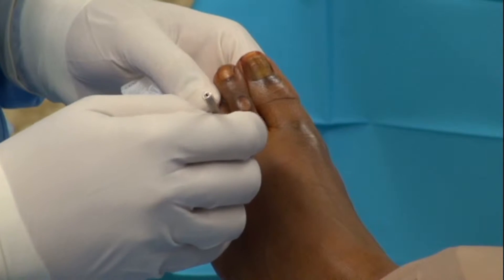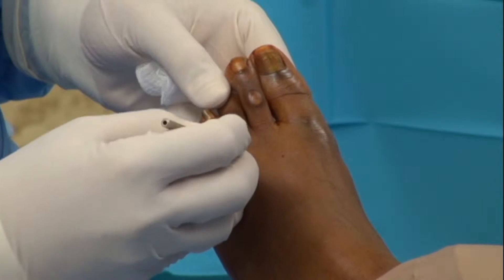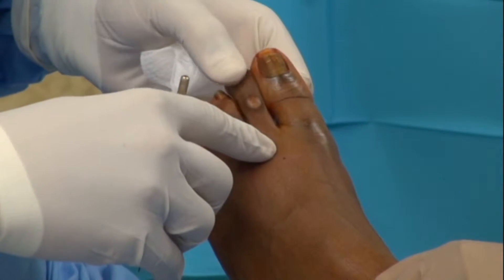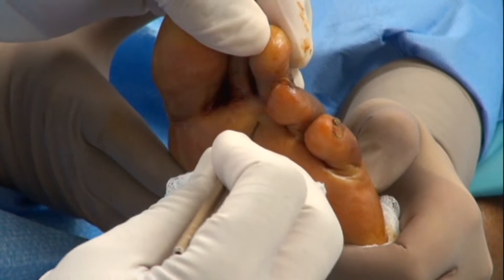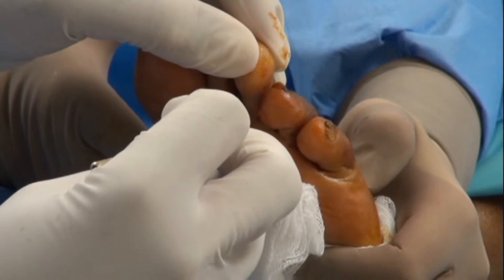Using a number 67 MIS blade, extensor tenotomies are performed through a percutaneous incision deep to the hood apparatus. Following the extensor tenotomies, flexor tenotomies are performed.